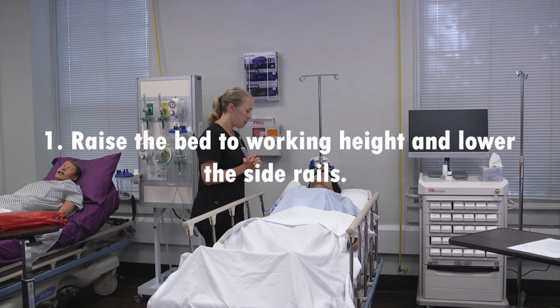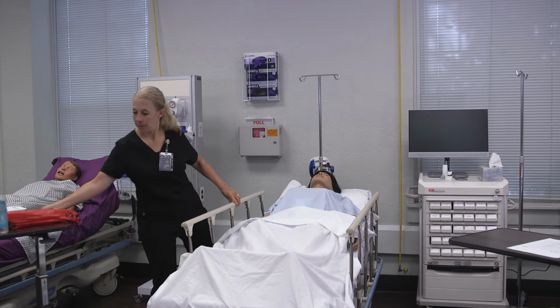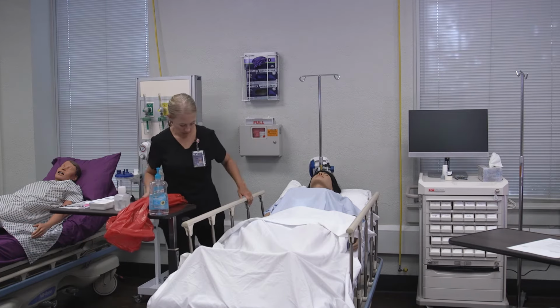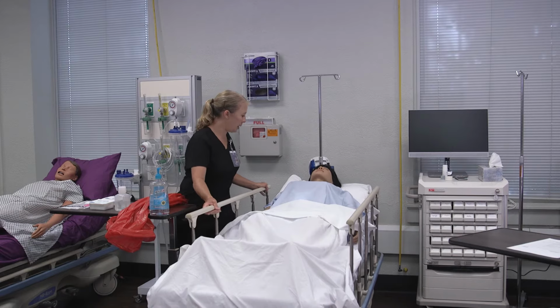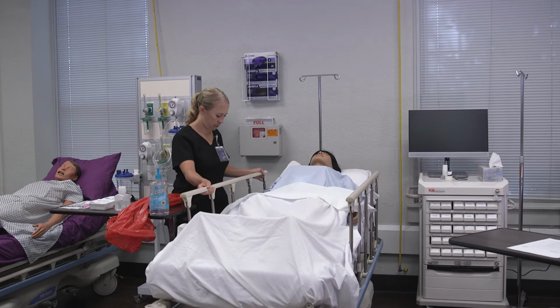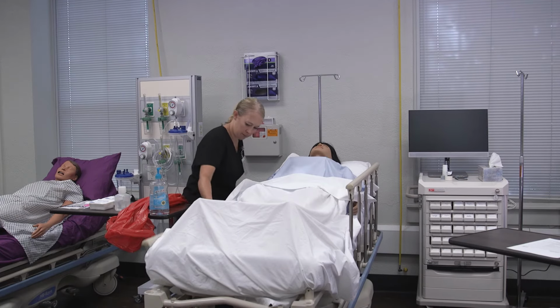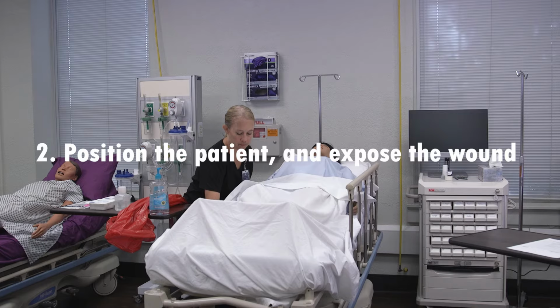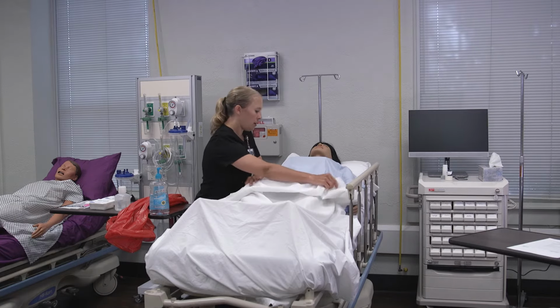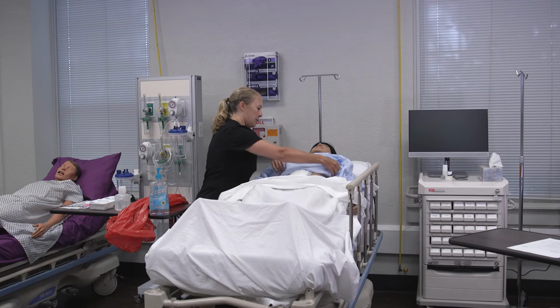Raise the bed to working height and lower the side rails as appropriate and safe. So, Ms. Wilkins, I'm going to raise your bed up, and I'm going to need you to be really still when I do that, so that I can have you where I need you to be to do the dressing change. This has to be at my waist height, so I do have to put you up pretty high. Position the patient appropriately and expose the wound. I'm going to pull your sheet down and your gown up. I am going to try to keep you as covered as possible, but I do need to make sure I give myself plenty of area so we can get this dressing changed for you.